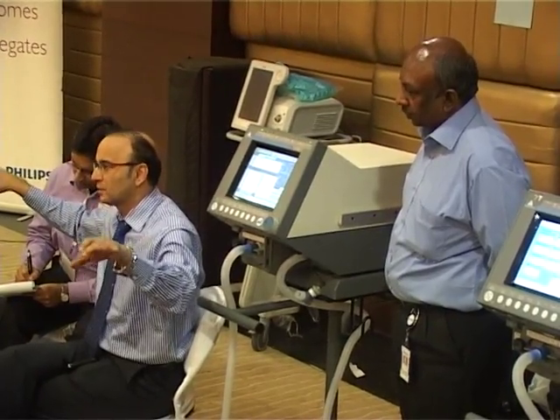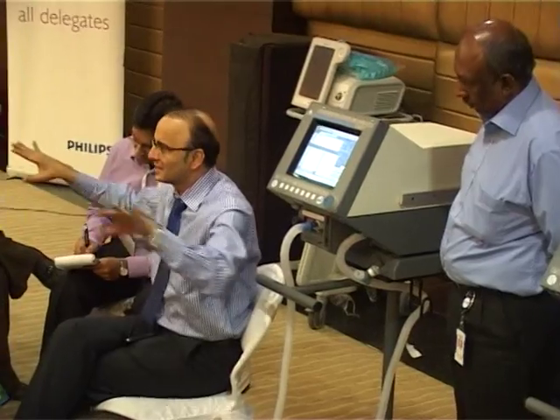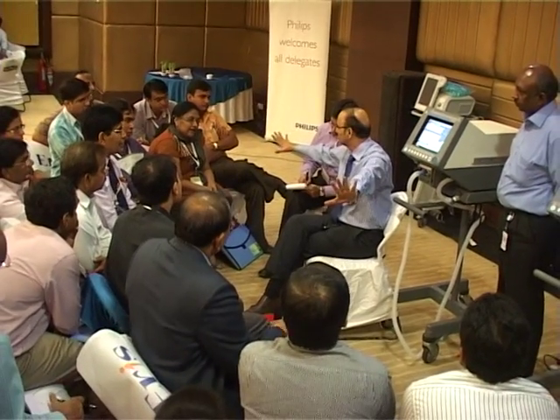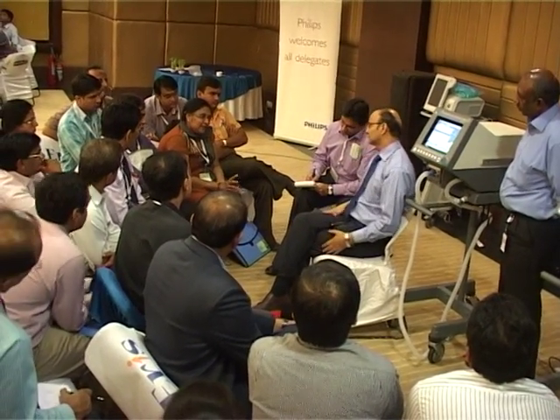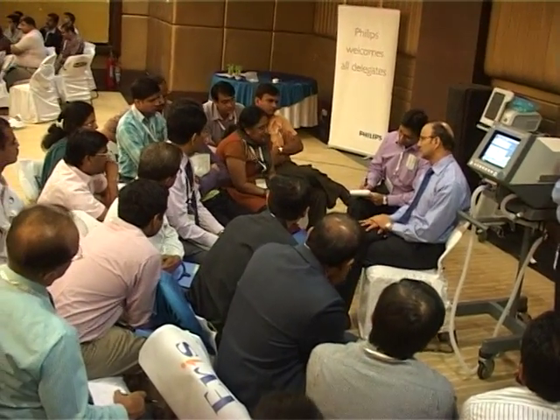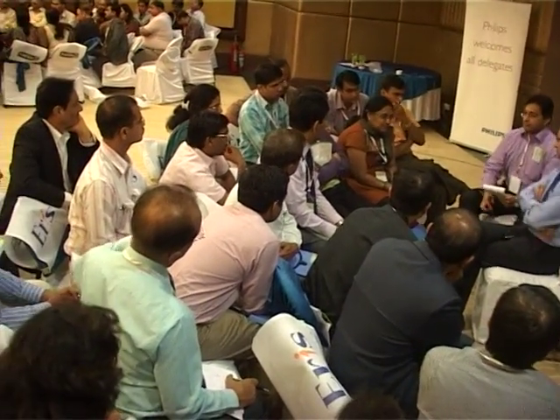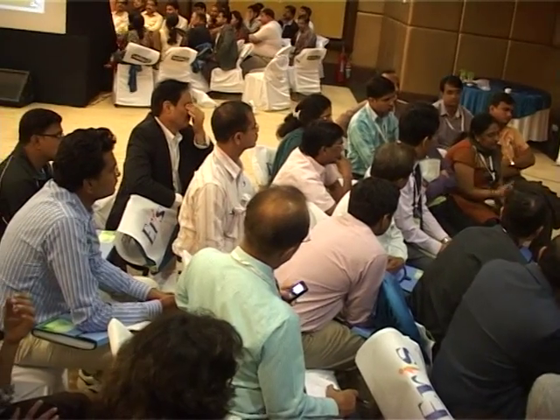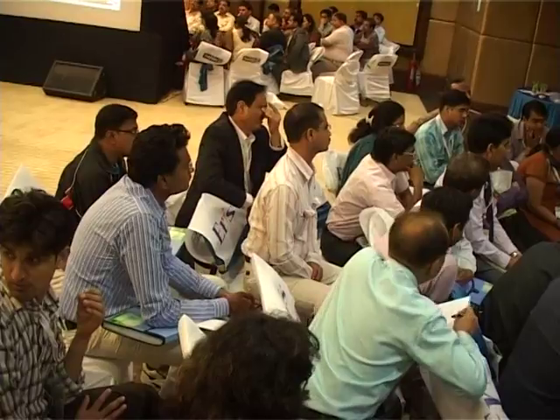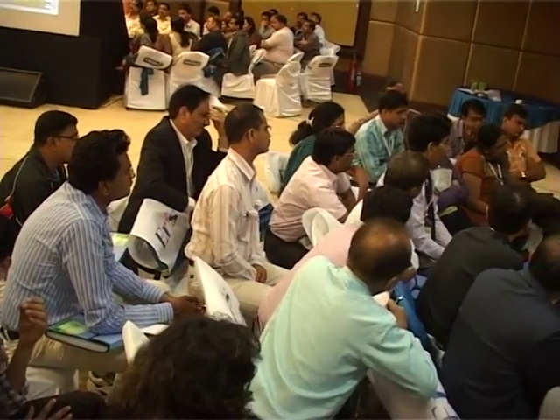CPAP, or you call it pressure support, is the same. But if you're not giving any pressure support, it becomes a simple thing. You understood? Patient is breathing well, so nurses control. Then what will be the advantage of putting the patient on SIMV with pressure support, if the patient is breathing spontaneously?